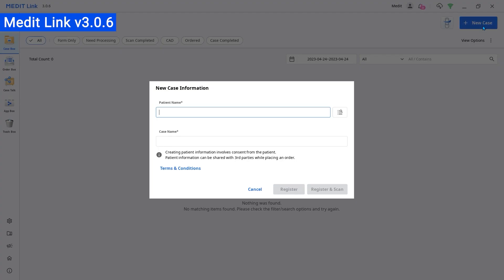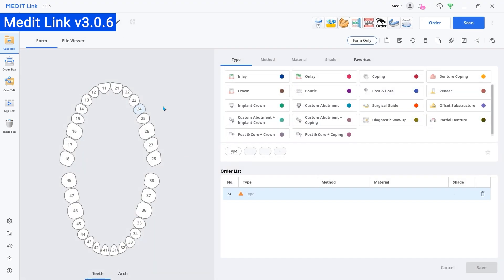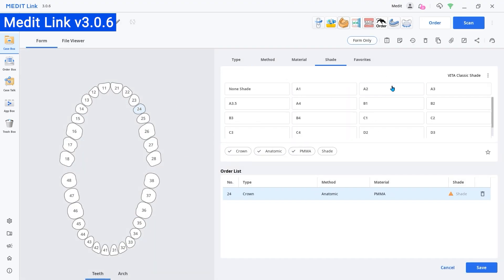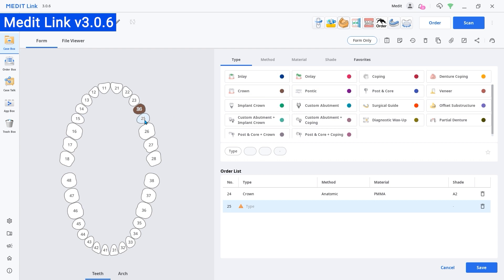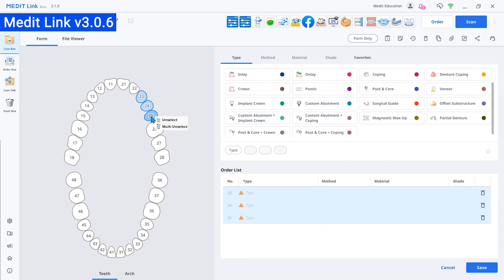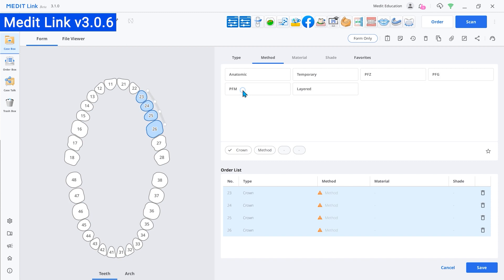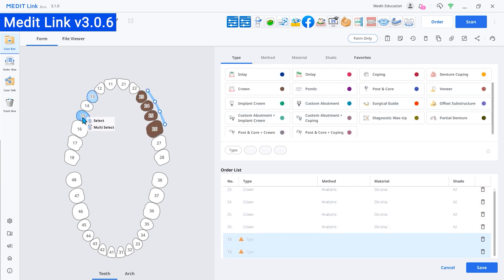This update also includes several improvements. Firstly, we've improved the user experience for filling out the form. Now, tooltips and guide messages will provide users with clear guidance on available actions.